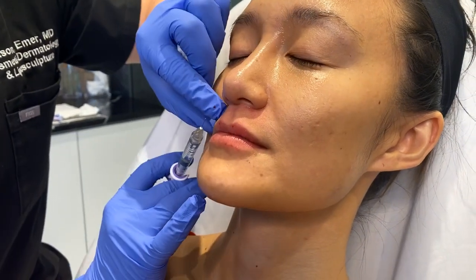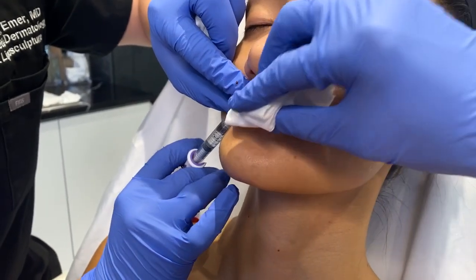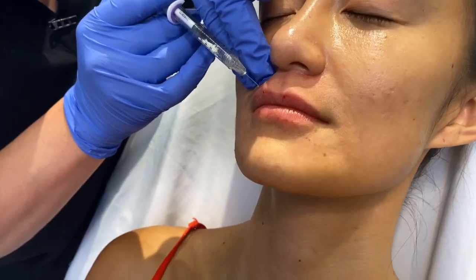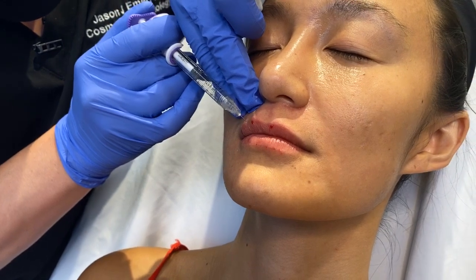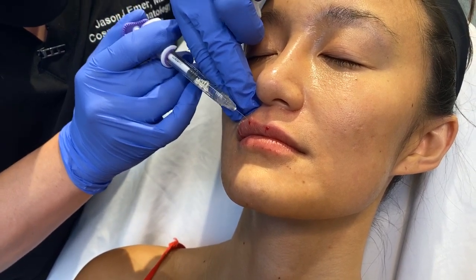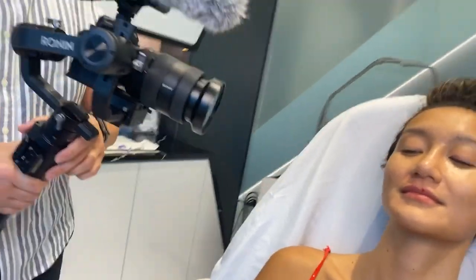So we're gonna do, again, just a little, nothing crazy. Good. And then again, for her, I really just want that center part to be a little more defined. And we can do a pillar technique where we try and get this to lift up a little bit more at the edge, but we don't want hers to look too overdone. So we'll do a small amount to give her a little bit of volume there. That side's done. We'll take a look.